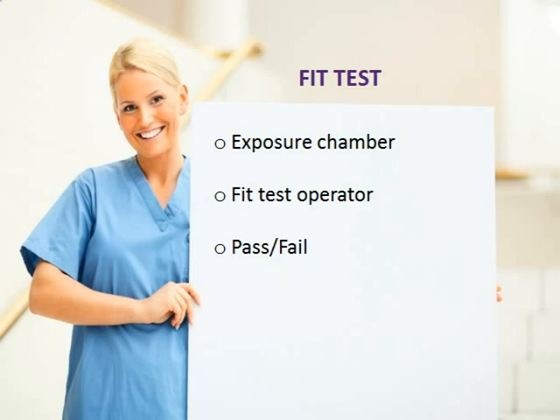From the wearer's response and the fit test operator's observations, the fit test operator determines if the respirator that was tested is effective and may be assigned to the wearer. If the wearer does smell or taste anything, then the respirator tested is not effective. The entire test can take 15 to 20 minutes or until an effective respirator and fit is determined.